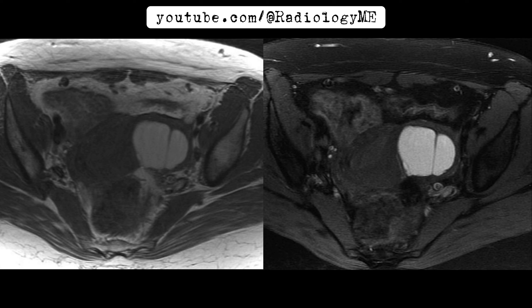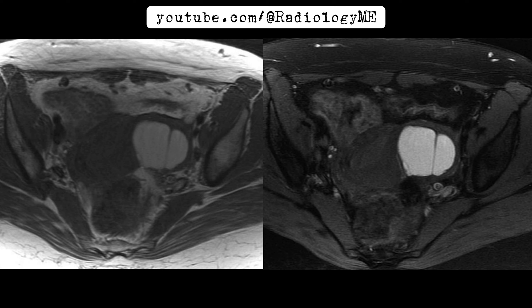Endometriotic deposits, or plaques, are another important imaging feature. These appear as intermediate signal intensity masses with areas of high T1-weighted and low T2-weighted signal. In this case, there's a notable peritoneal plaque visible on the T2-weighted sequence, extending from the dorsal aspect of the uterine body to the anterior surface of the sigmoid colon. There's also typical tethering of the bowel and layering of the ovarian endometrioma, which are hallmark signs.